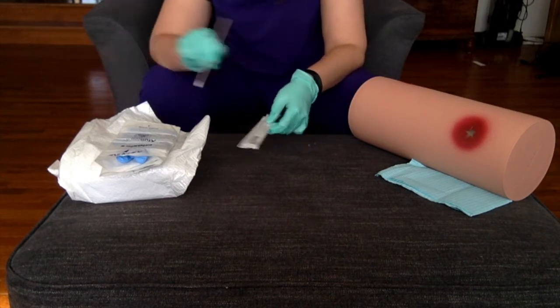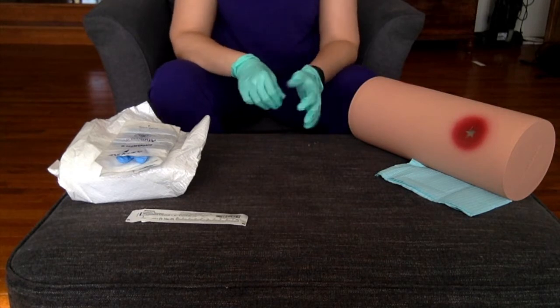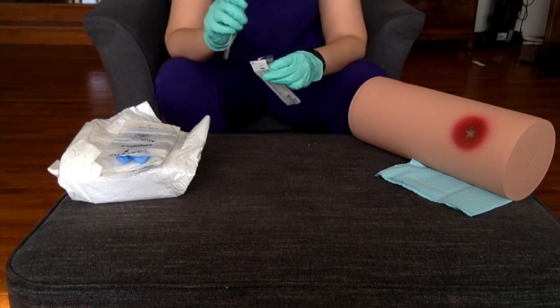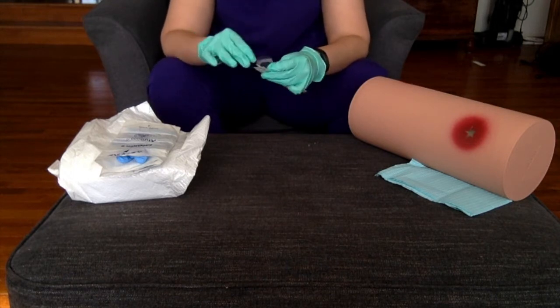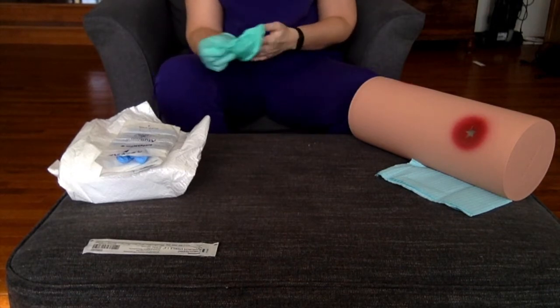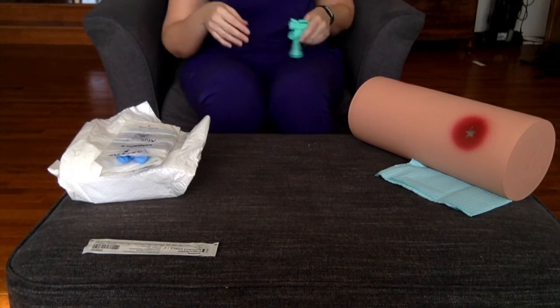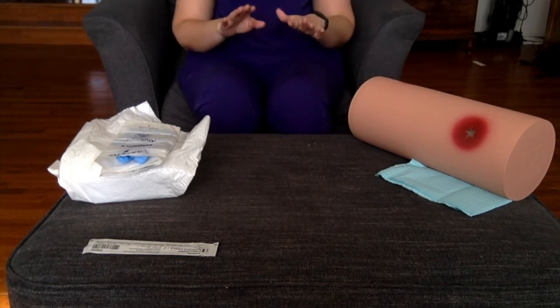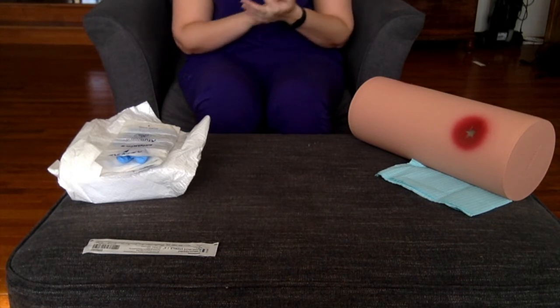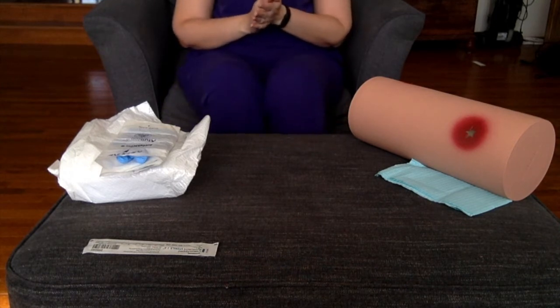At this point I can trash the applicator and get my patient ready for the procedure. I'll show you guys how to drop things into the sterile field as well. At this point I can get rid of these gloves. I do have to do hand hygiene again because I just touched a possibly dirty wound, so I've got to wash my hands again — 20 to 30 seconds of scrubbing with alcohol-based sanitizer or soap and water.